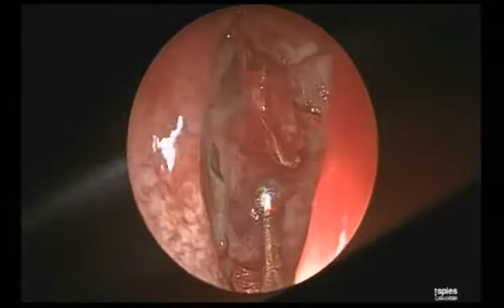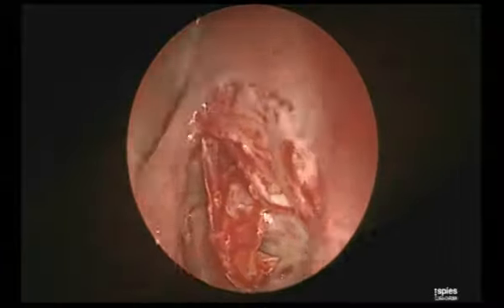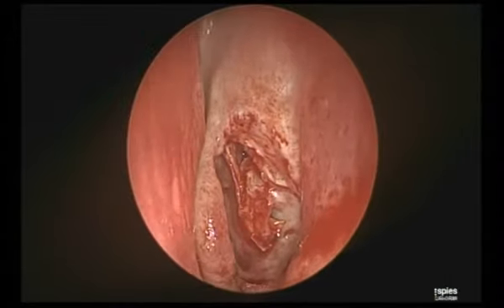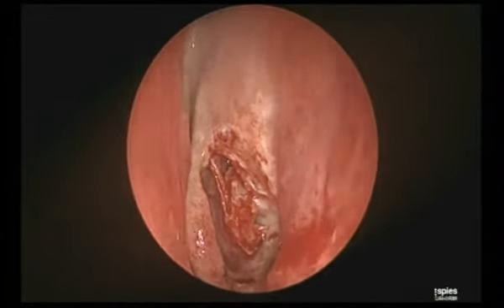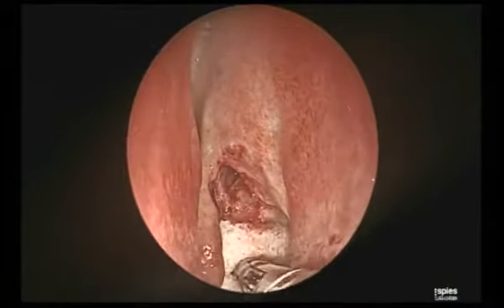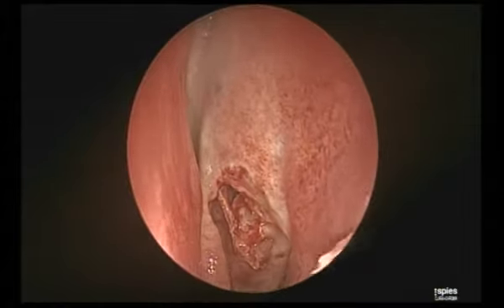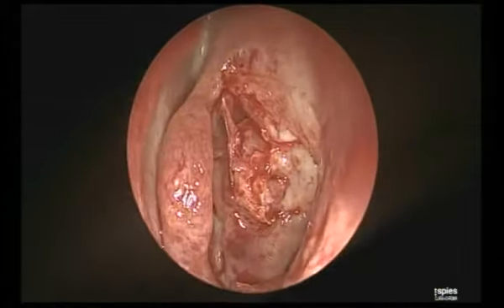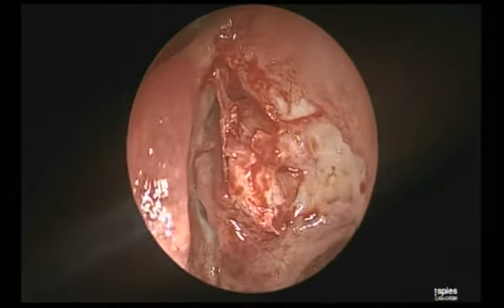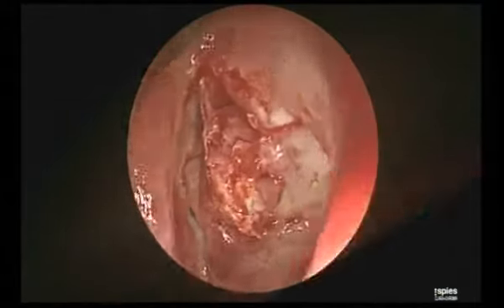Third is this bulla. This bulla is one structure, and in our experience, over 98% of the time it goes up to the skull base. I'll show the attachment where it goes up to the skull base, and wherever it gets attached onto the skull base above, the anterior ethmoidal artery is just behind that. So the bulla automatically covers the anterior ethmoidal artery. As long as you keep the bulla intact and stay anterior to it with a 70 degree scope, keeping your medial and lateral limits in view, you practically don't damage anything.